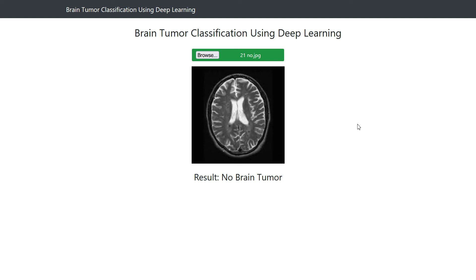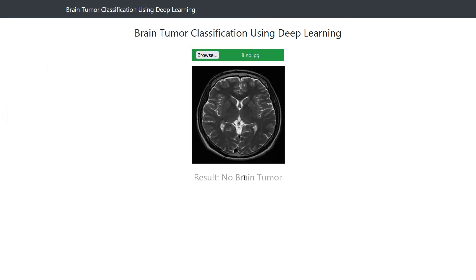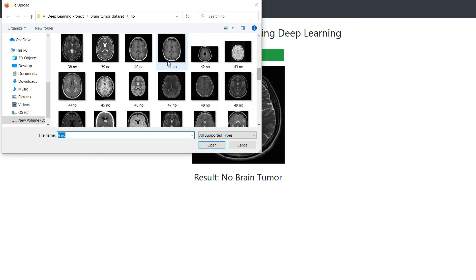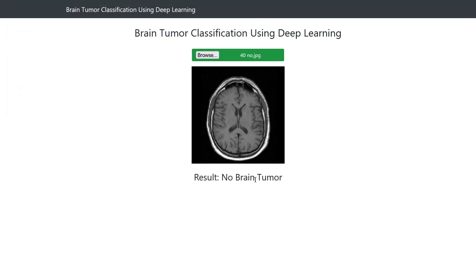This is the demo and you can see here this is a web app: brain tumor classification using deep learning. I will try to browse a picture here to classify the image. If I click here to browse images, you can see the label is 'No'. Let's choose another picture and click predict — no brain tumor. Let's choose another one, open and predict — no brain tumor.